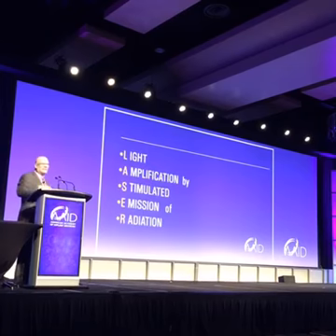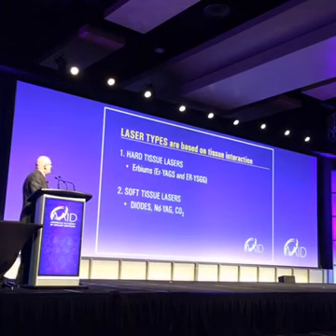So what exactly is a laser? You get a little physics lesson here. Laser stands for light amplification by stimulated emission of radiation. That's all you need to know about that.